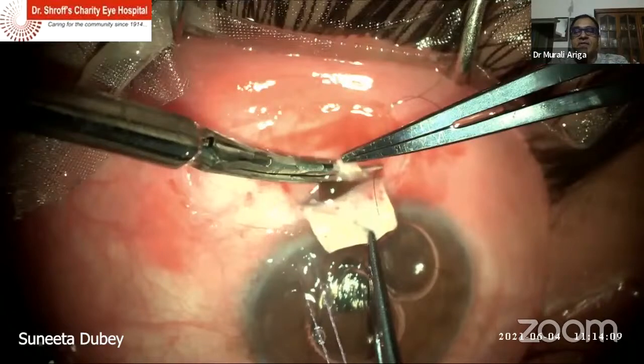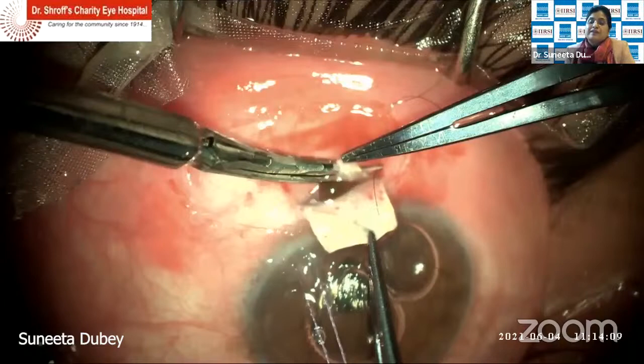You want to prevent hypotony duration. Yeah, as Aurora is saying, if you have pre-placed sutures, you can tie immediately. Especially for beginners; if you are a very experienced surgeon, then it is okay, you can put sutures even in a hypotonous eye. But if you are not so experienced, then I think it is better to put pre-placed sutures. We always use at least one pre-placed suture.